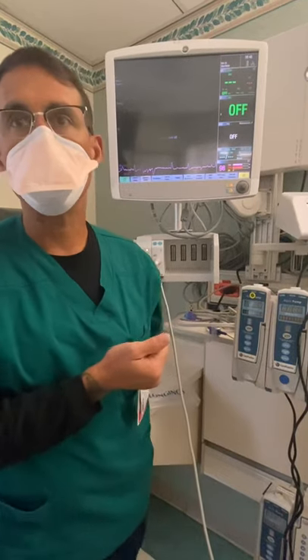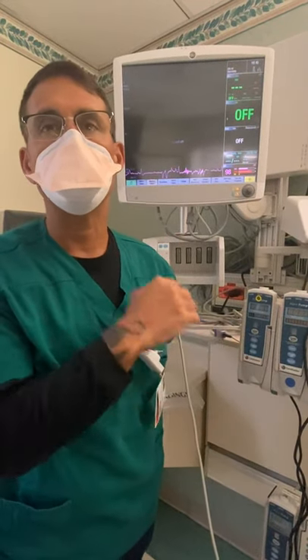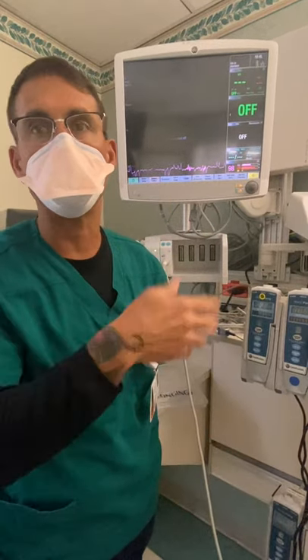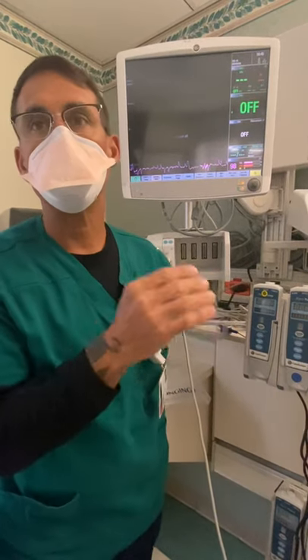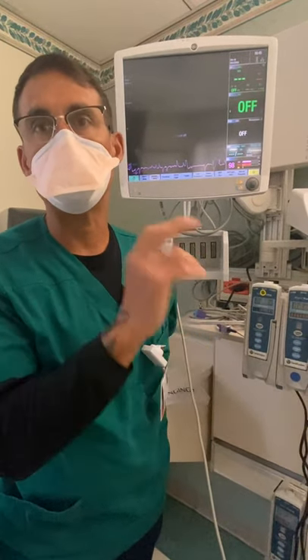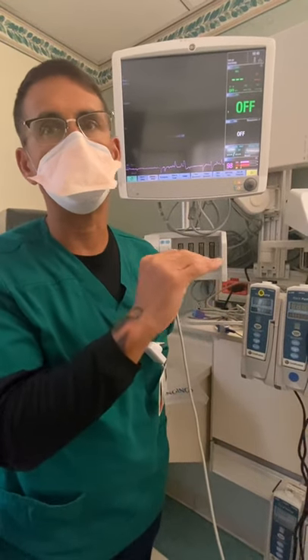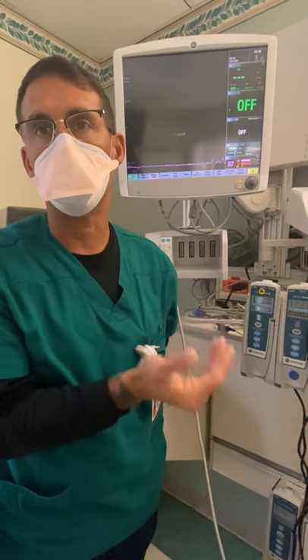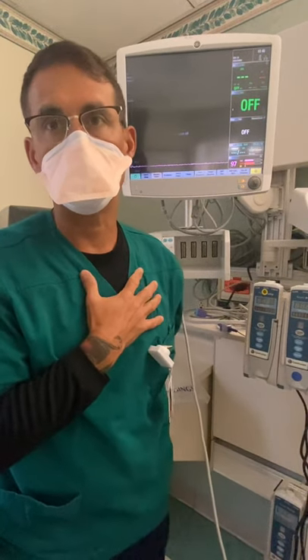If you come in the room and the vital signs are always abnormal and you don't have anything to blame it on, there's no new infection, the patient was normal before and all of a sudden it's up and it doesn't go down, they don't have a fever, that patient is also not sedated and you're going to titrate up. If you make a few titrations and the vital signs stay up and you feel this patient has done a lot of things, then maybe there's something underlying going on that we don't know about causing the abnormal vitals. But we are going to go by the vital signs when you're not using BIS.